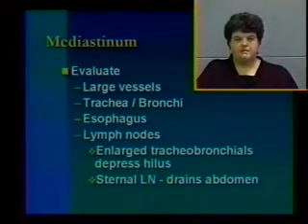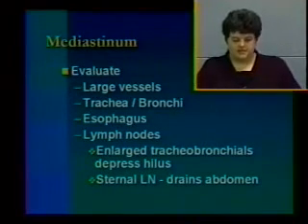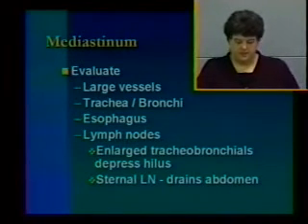And the big key is to remember that the sternal lymph node, which sits just dorsal to the second sternebra, drains the abdomen and not the thorax. So if you see sternal lymphadenopathy on an animal that you don't suspect lymphoma on, you need to go look at that dog's abdomen, because it may be that the primary disease is originating there.